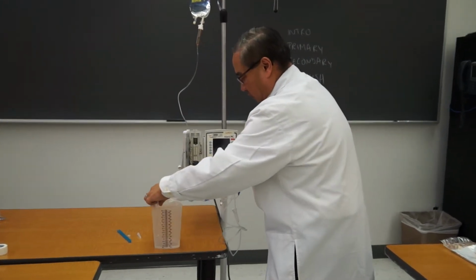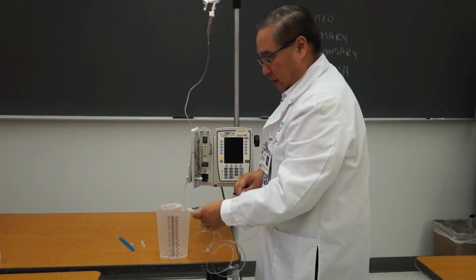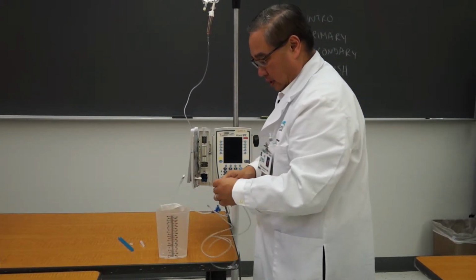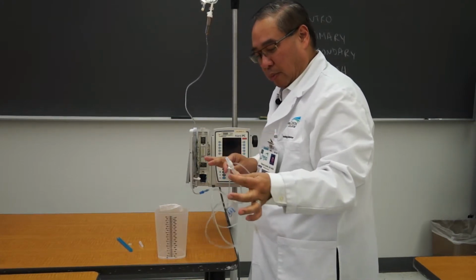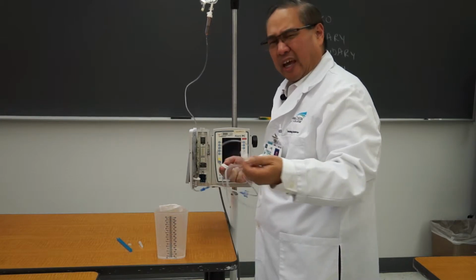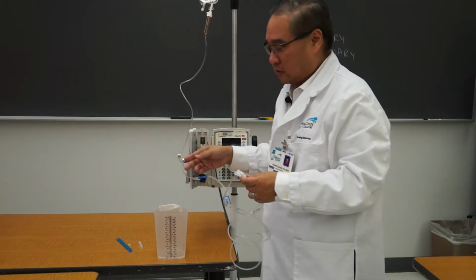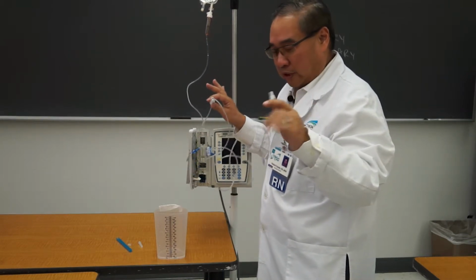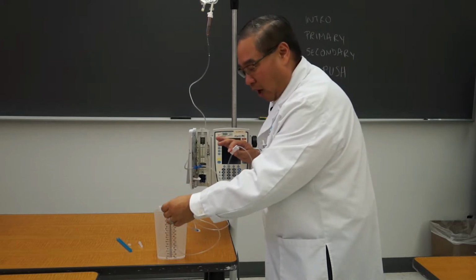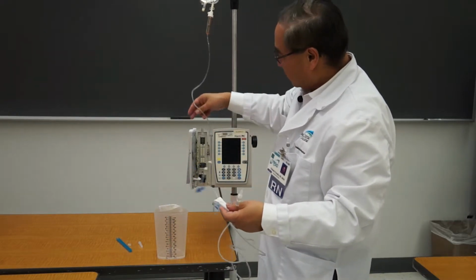I'm going to be careful not to, I'll use a graduated cylinder here. I'm not going to touch this end against the end of the trash can because it'll contaminate it. Even with the cap on, I always want to simulate that I want to keep the equipment as clean as possible. And you can imagine that you don't want the patient, their family, their friends to see you using something that looks like it's really important and you touch objects that are contaminated or dirty.